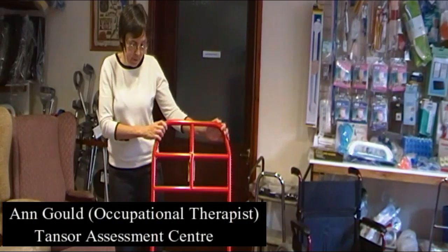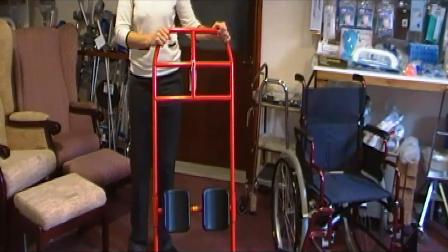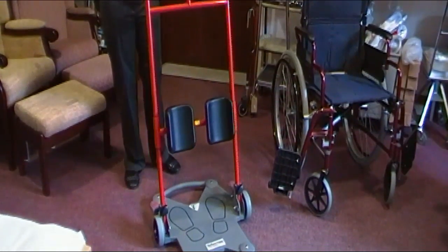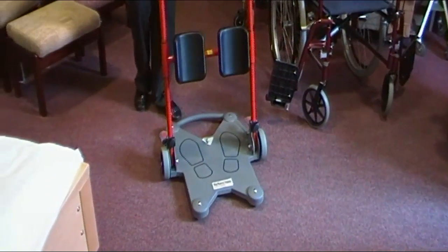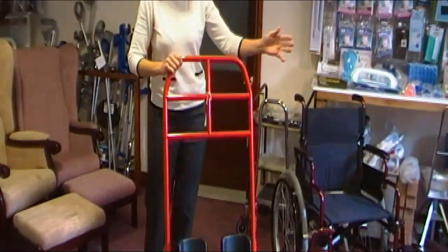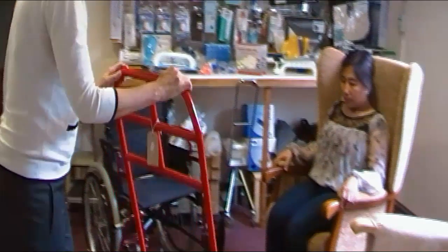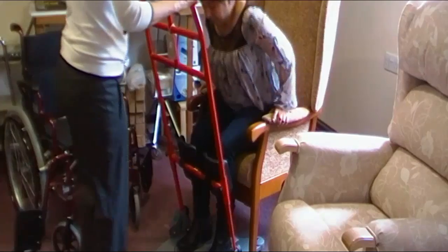This piece of equipment is called the Return 7500. It's particularly useful because once a person is standing up, you have the facility to move them as well instead of just swivelling them on the spot. So I'm going to demonstrate with Grace how it's going to assist her to get from her chair onto the wheelchair. Right, Grace, what I want you to do is to put your feet onto those footprints, and I'm going to put the brakes on.